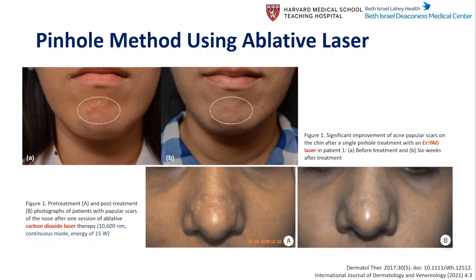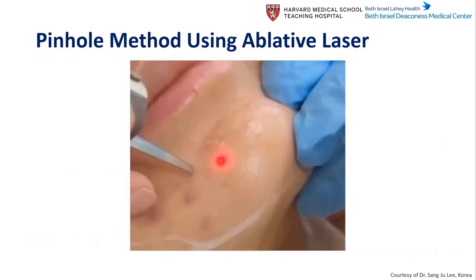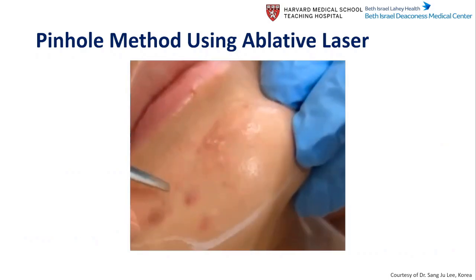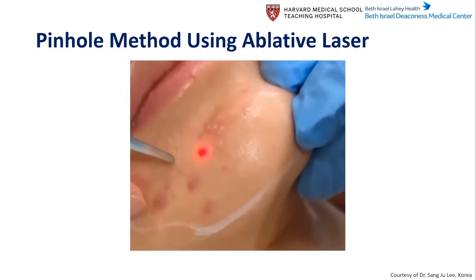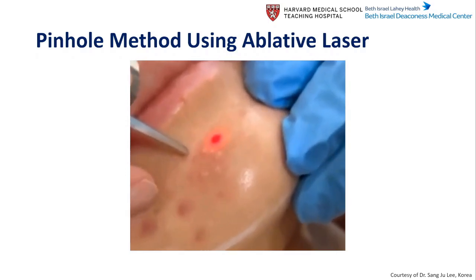And Dr. Lee used a pinhole technique with erbium YAG laser in continuous mode. And then a subsequent report from India used a continuous mode of CO2 laser. So I got this video from Dr. Lee. Basically, you are using continuous mode and then creating very tiny tissue ablation within the scars.